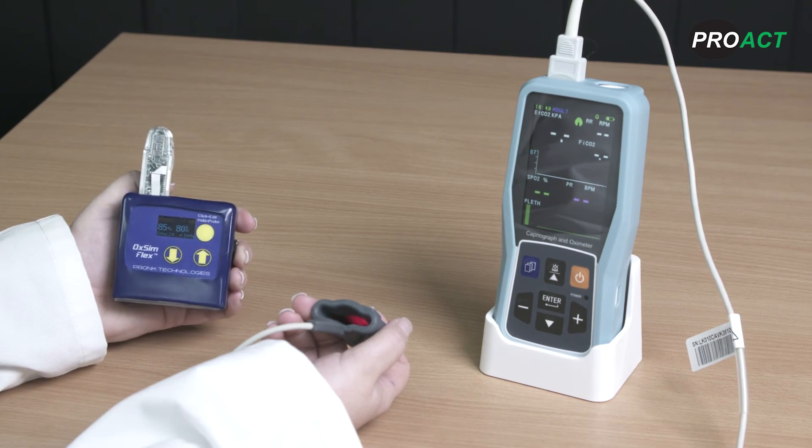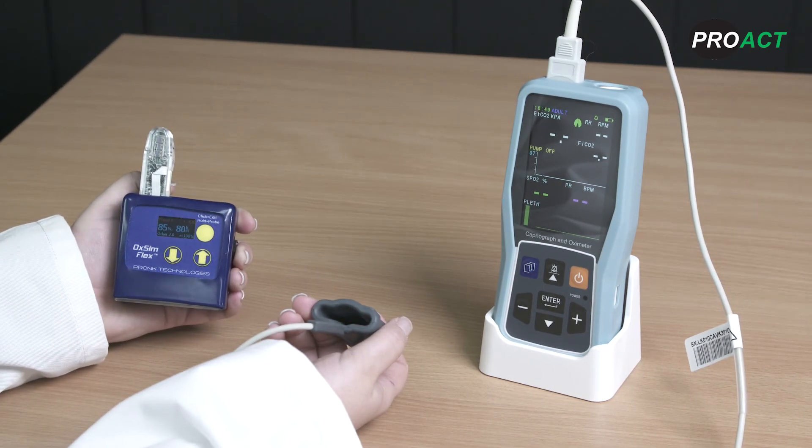SPO2 validation procedure. The next step in checking the PC-900B is to verify the oximetry and pulse rate accuracy by using a pulse oximetry simulator. In this video, we will be using the Pronk Technologies OxSimFlex Ox2 set to Auto 2.0 mode. This is very important as this ensures that the Ox2 gives the correct signal to the PC-900B pulse oximetry sensor.